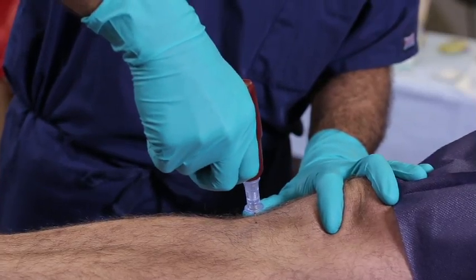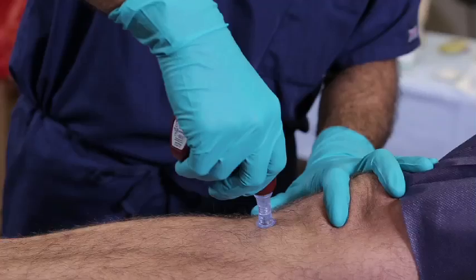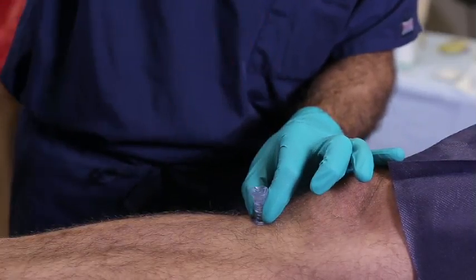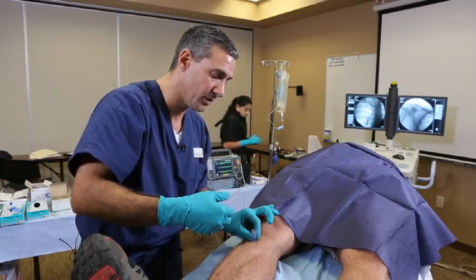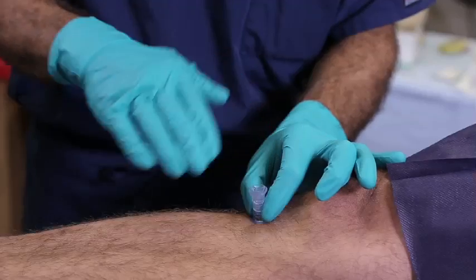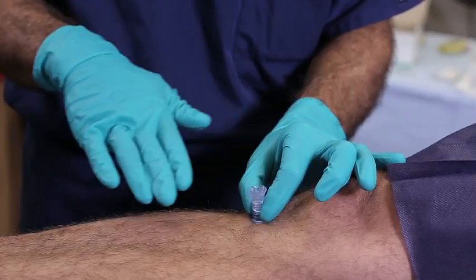Gently advance the needle until you're essentially flush with the skin. You want to make sure you feel that drop or loss of resistance, and then advance another one or two centimeters. In most adults, you're going to apply this so that it's flush with the skin, and you want to make sure you're perpendicular to the plane of the tibia.